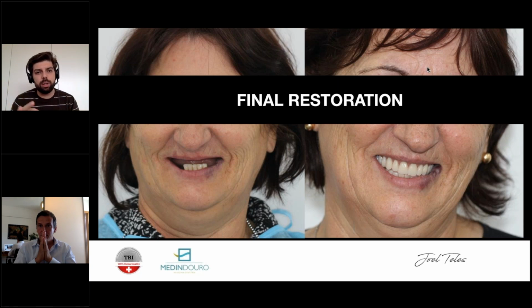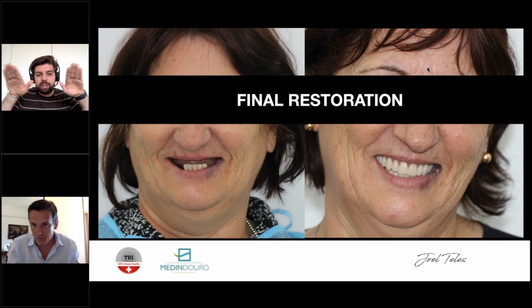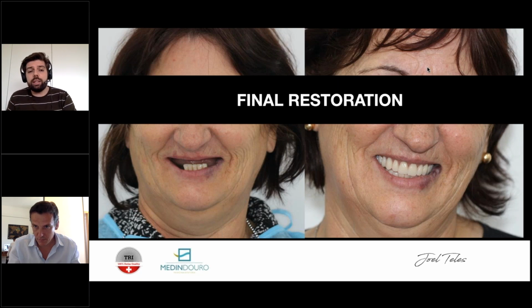It was very small lip support. We didn't want to end up with no lip support whatsoever and a really resorbed area. That's another question that you need to think about. That's why making the shelf like this is very important, to add a little bit of lip support. So all these considerations in a one-step surgery add to these results.